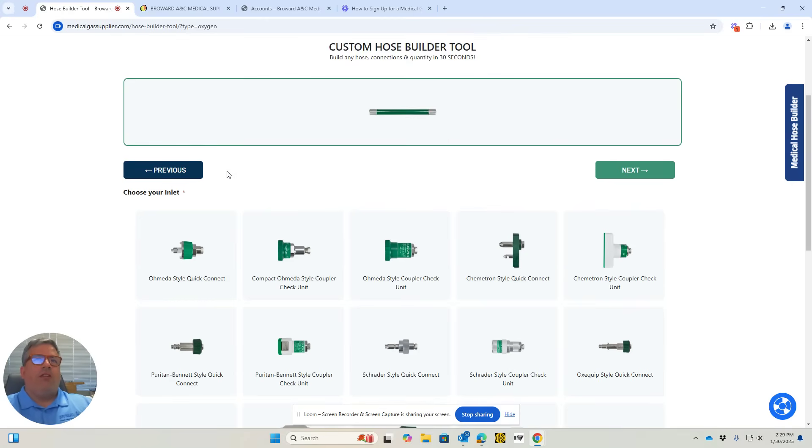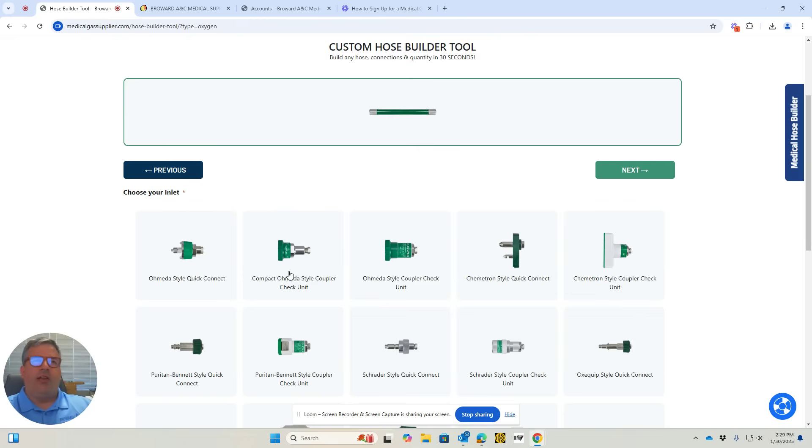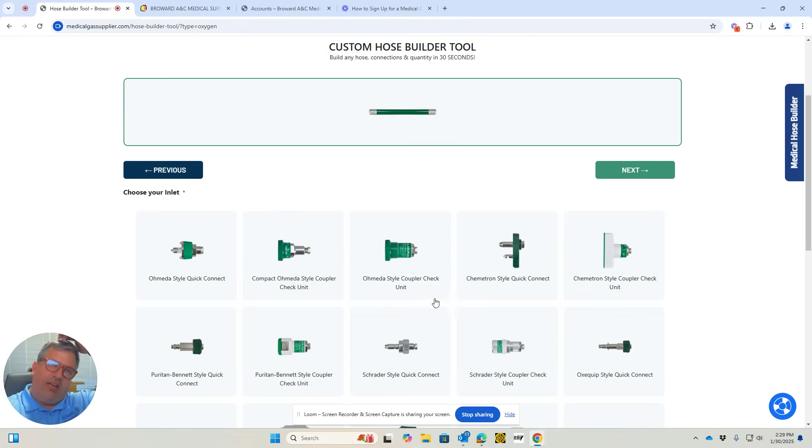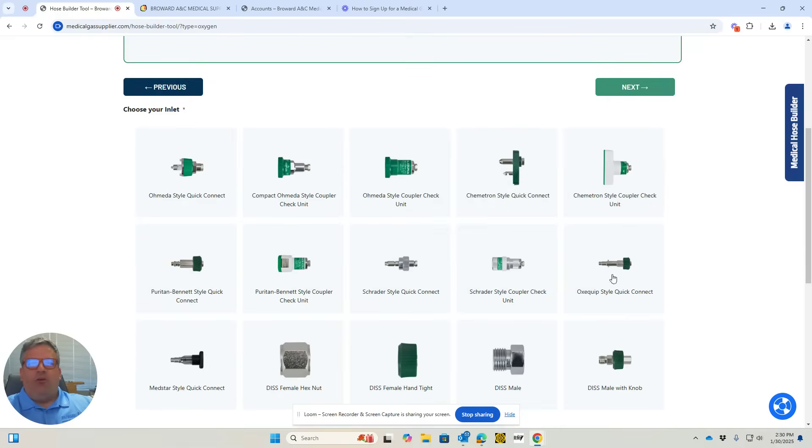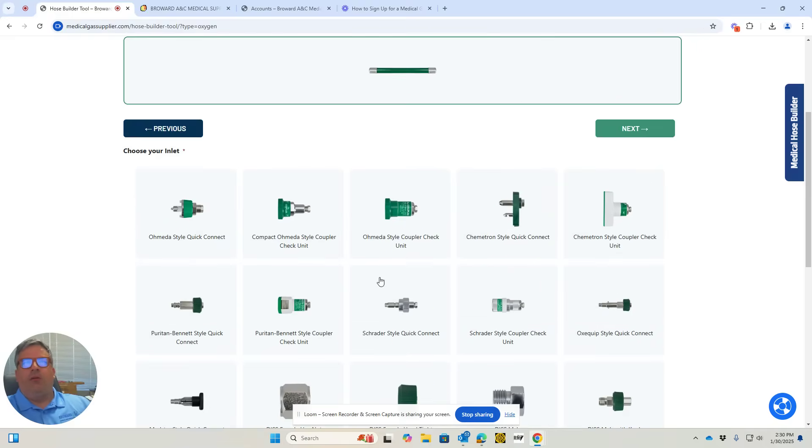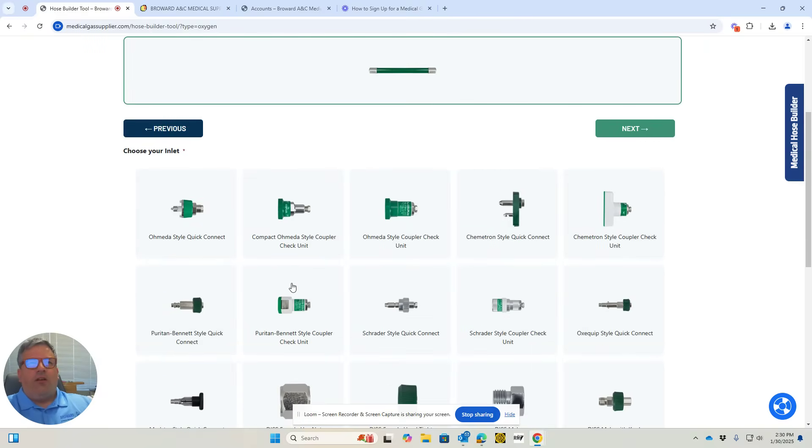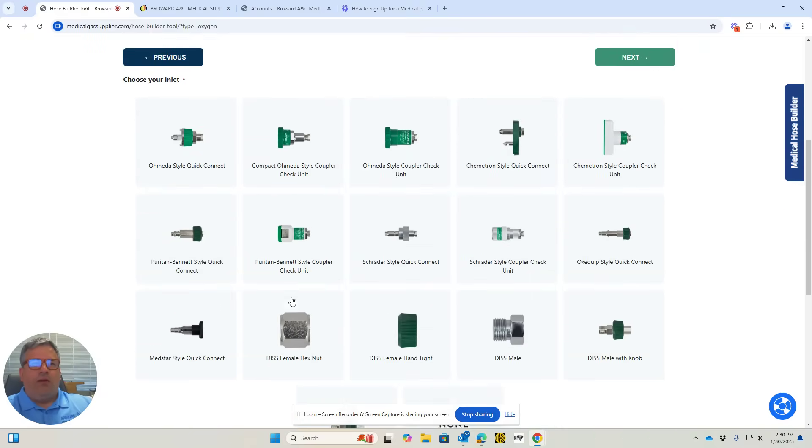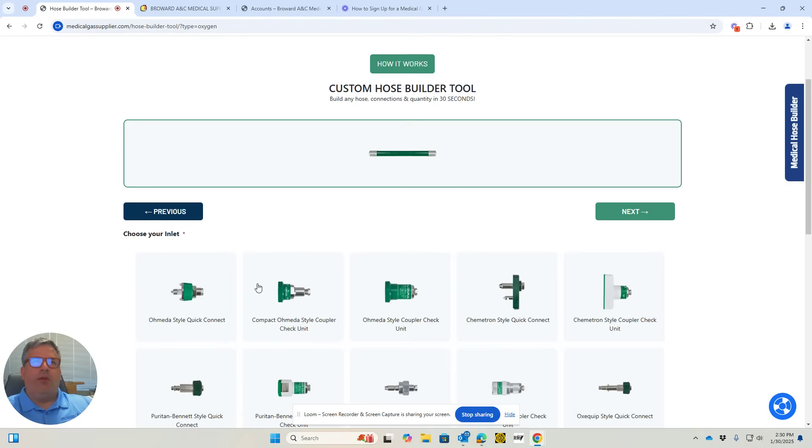Next, it's going to list the fittings. It doesn't matter which side has which fitting, as long as you select the correct fittings. All the styles are listed here—you have Omida, quick connect, and others. This gives you a good view of all the styles and what they look like so you can make the correct decision and order the proper hose. I'll show you a common hose that most people use.